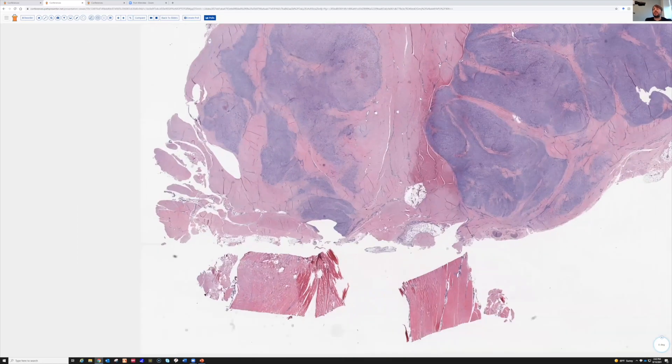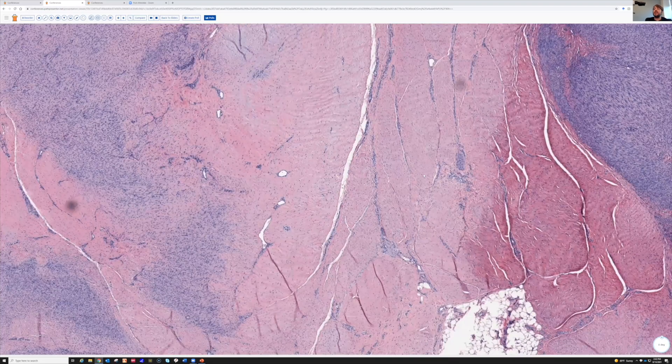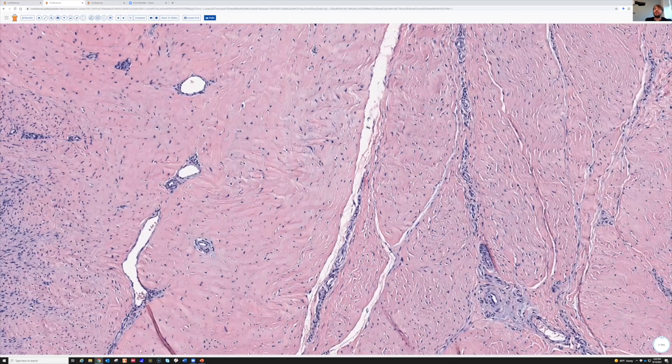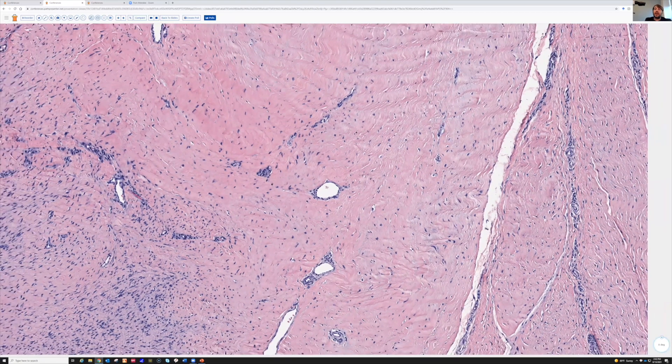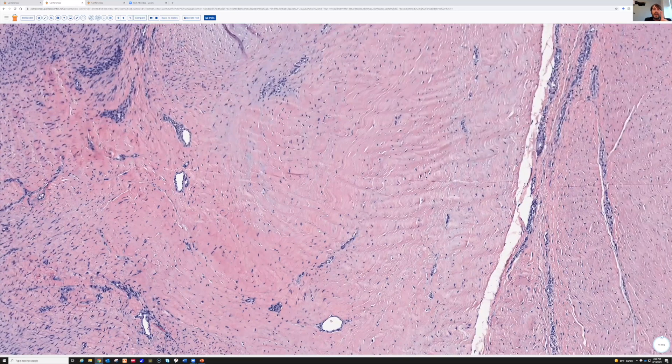Let's look at the pink stuff first. This is dense, regular connective tissue — very dense pink collagen, bland little fibroblasts in between, and look at those waves there. Very wavy. Too wavy to be nerve.